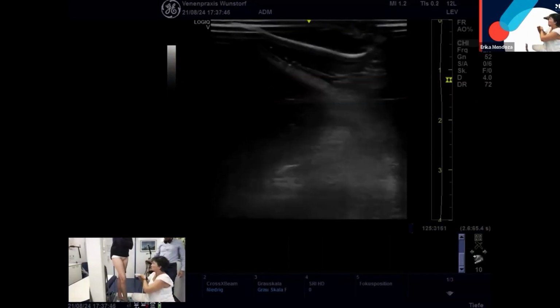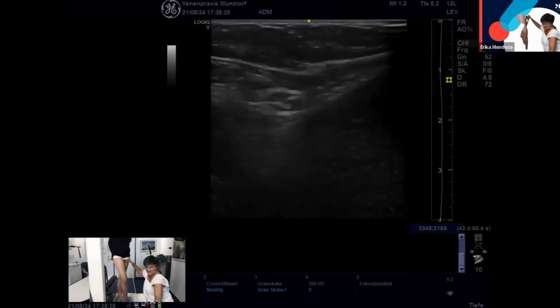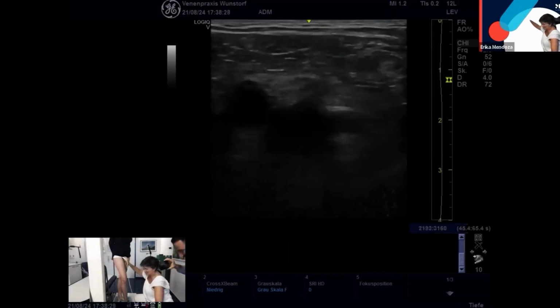I start with the line as we have always done. Perhaps, Magnum, do you want to show? I have my setting in the room where I treat the patients. I have a second screen on the wall, so when I treat the patients I don't have to look down, but I can look straight forward. For doing sclerotherapy, I can turn on all the lights and see the veins better with ultrasound, without the light or directly with the light. This is my personal setting. You have to be careful with the latest change.